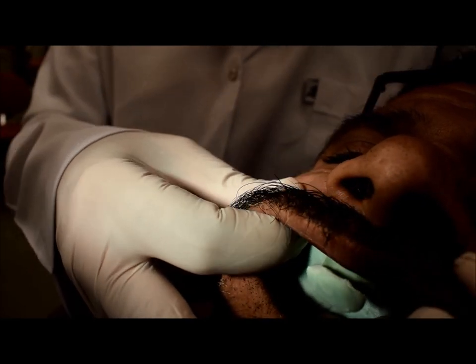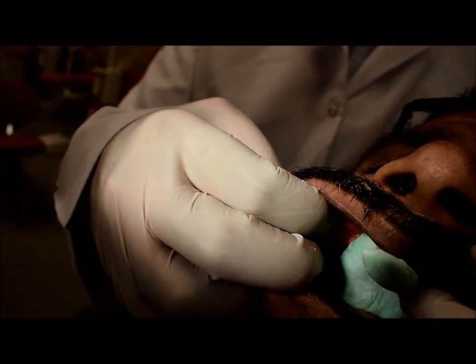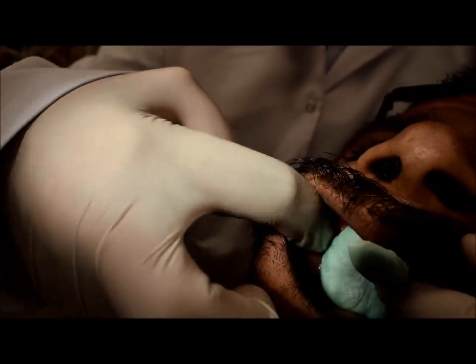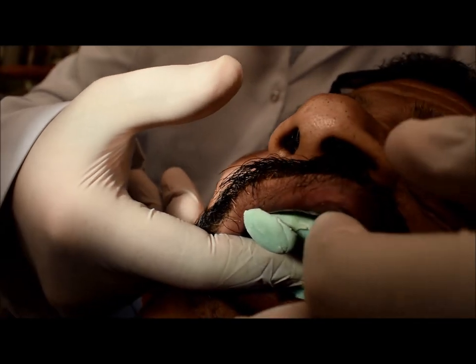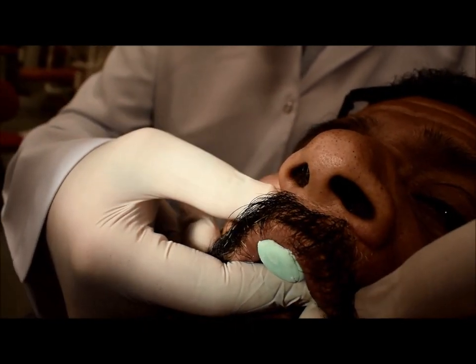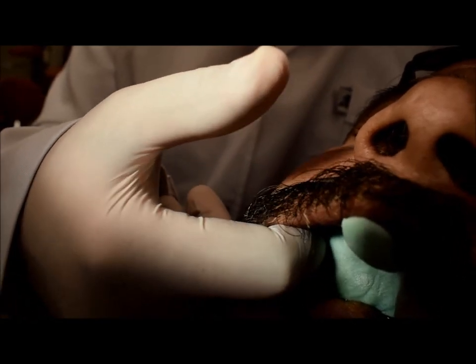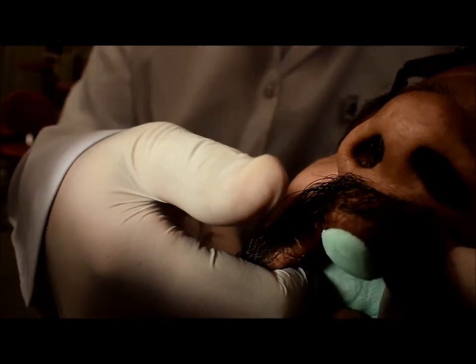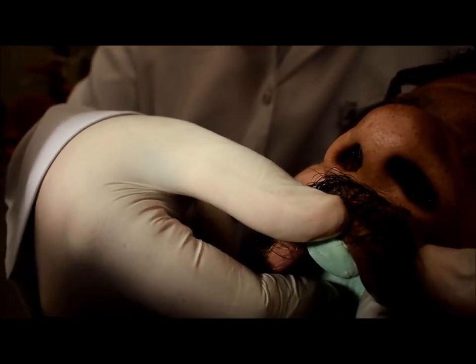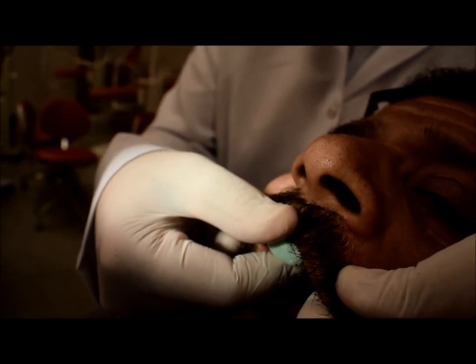This is for the labial area. For the buccal area, it is a little bit difficult to check visually, so I have to check it digitally with my finger. I have to confirm there is 2 mm clearance. Usually, don't rush to shorten the tray at the distobuccal and buccal area because you cannot judge it properly — judge it during making the impression, and we will see if it is long or properly extended.